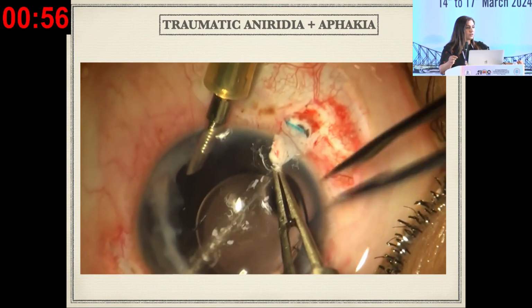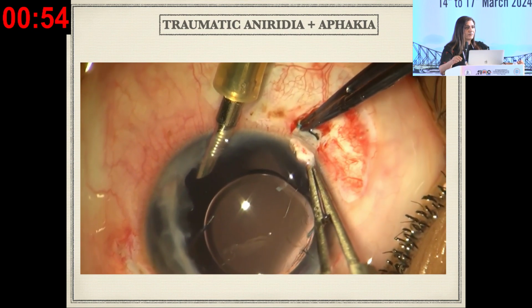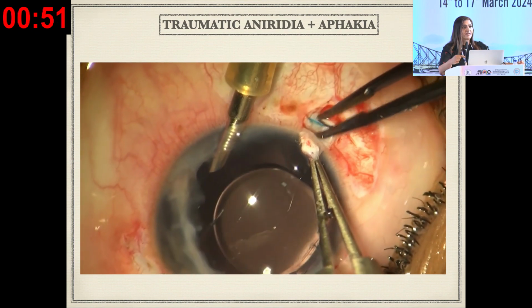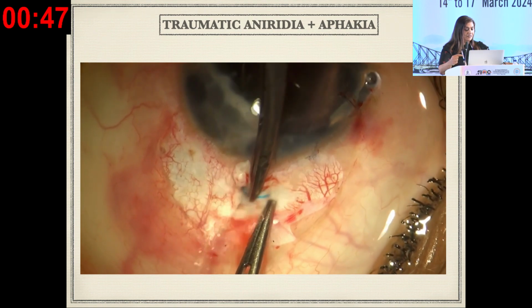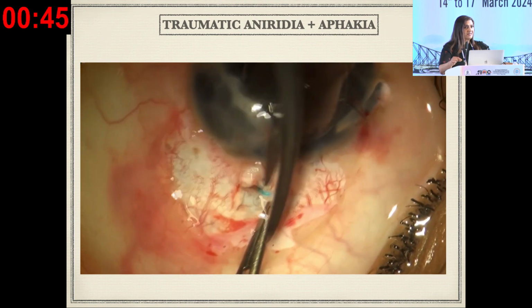and this is a young patient, so I do not want to do any kind of resurgery for this patient, because this is already a second surgery that is going on for this patient. So the haptics are then tucked into the scleral pocket. So this is the max that I could do for this case.